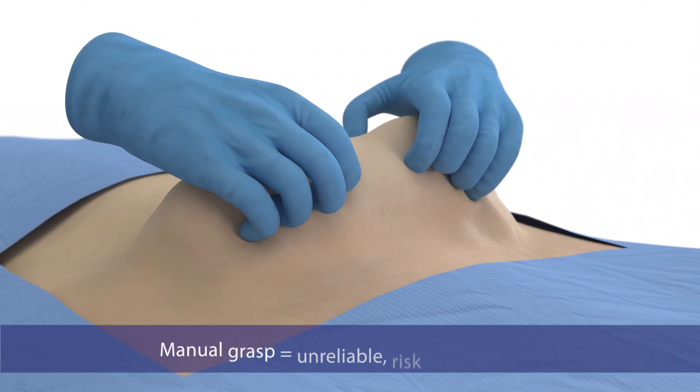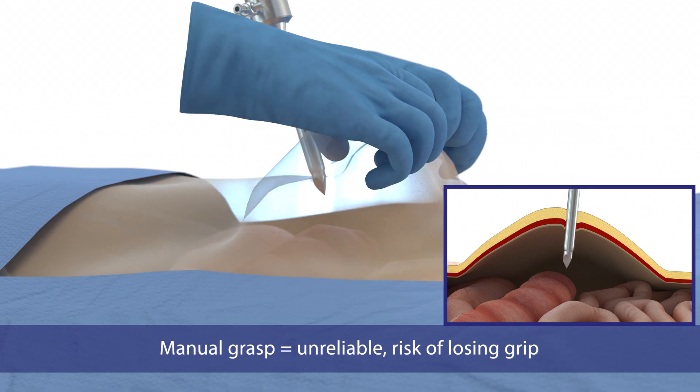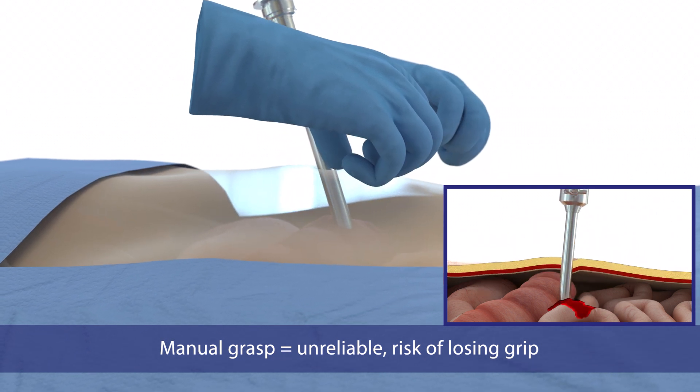With manual grasp, it's difficult to maintain grip and proper elevation, and the potential for losing grip introduces unnecessary risk.